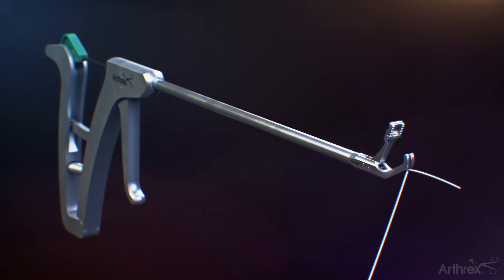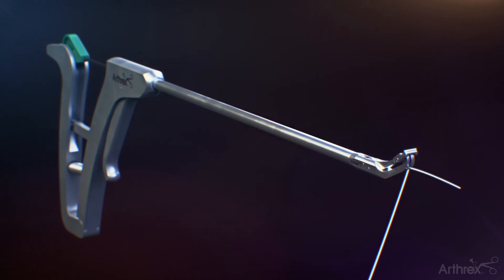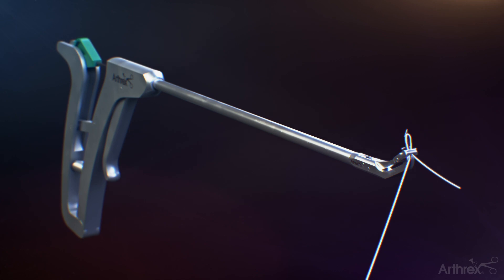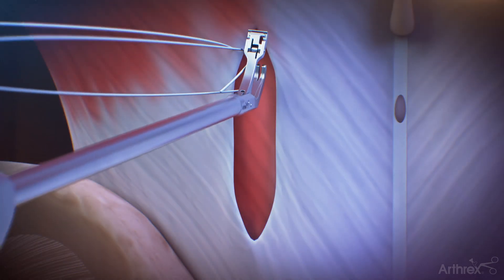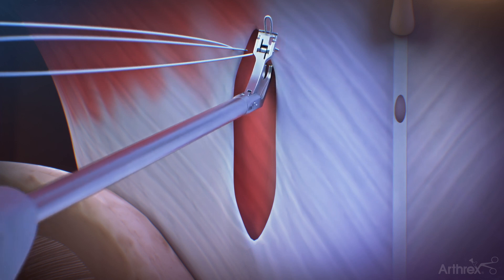To remove the suture, pull the trigger to close the jaw and squeeze the handle to advance the needle while using your opposite hand to pull the suture. Reload the suture into the Scorpion and pass through the other side of the fascia.